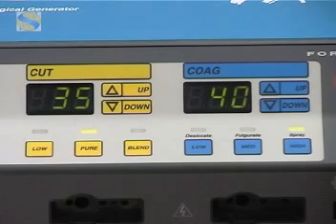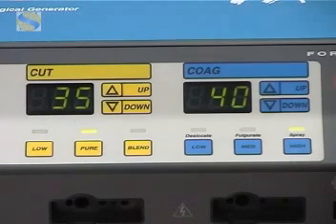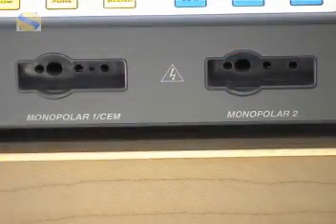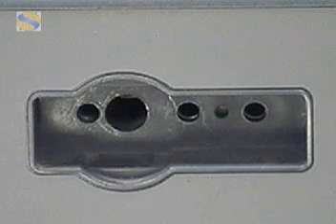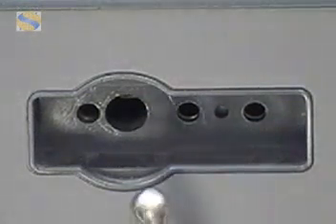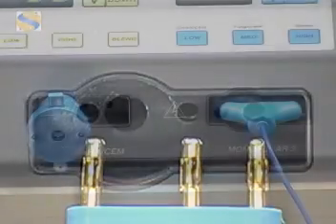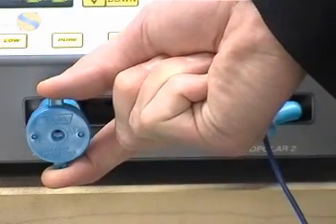Diathermy machines and accessories are universally colour-coded, yellow for cut and blue for coag. This colour coding scheme is reflected in the foot switches and finger switched instruments. The monopolar 1 and monopolar 2 output sockets on the front of the diathermy machine provide connections for a variety of accessories, both for finger switched and foot switched instruments, such as the 8mm foot switch and the 4mm hand switch connections. The insertion of an active adapter allows the use of monopolar cables of different diameters.